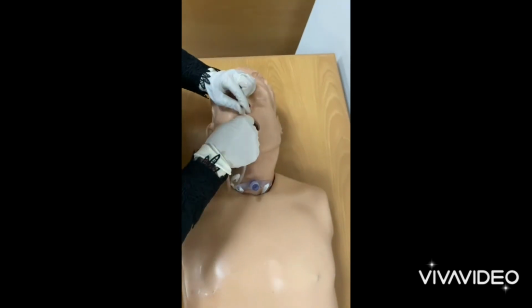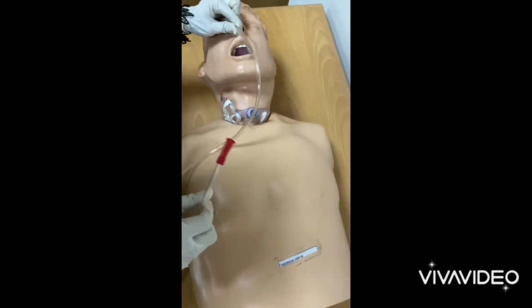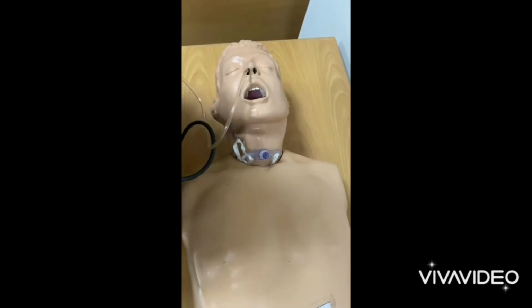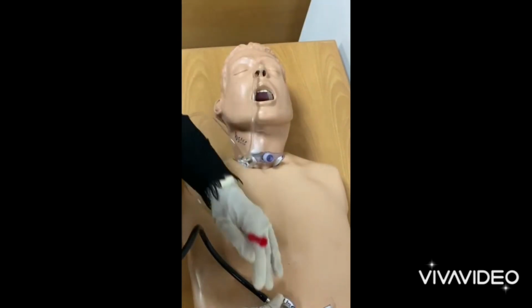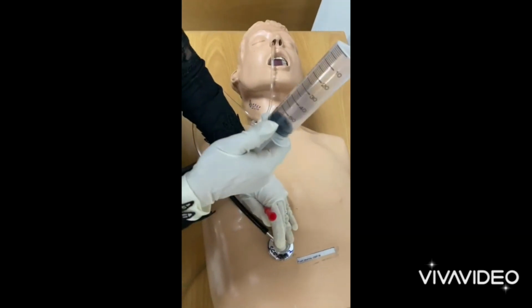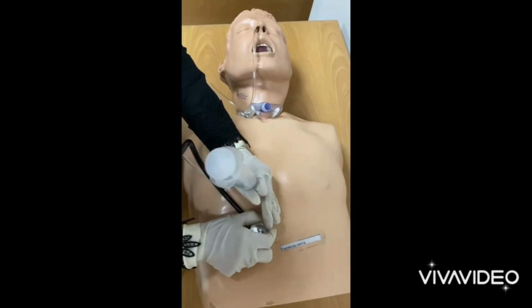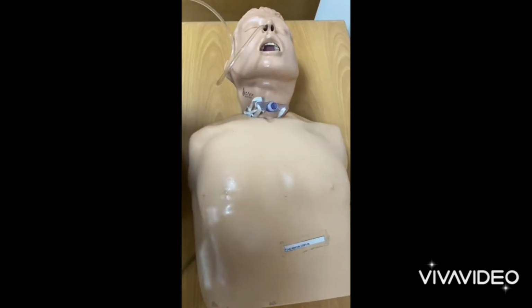you have to check for the correct placement of this tube. For that you'll need your stethoscope and your feeding syringe. Place the diaphragm of the stethoscope on the abdomen, on one side of the abdomen. Attach the feeding syringe filled with air up to 60 ml to the nasal end of this NG tube. And then blow the 60 ml air. You will hear a gurgling sound of air if the placement is correct.